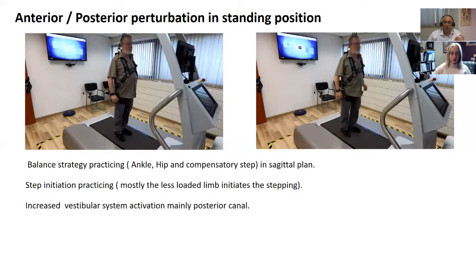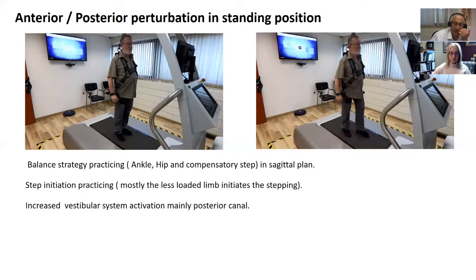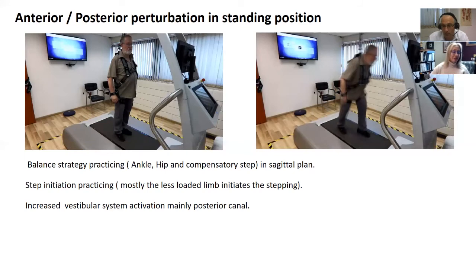That's correct. Now, we can also mix this with instructions. You quite rightly pointed out on that left-hand pane, the way that he is using that hemiparetic leg to actually contract and take the weight as he's moving his left leg back. Now, we can actually do that with instructions by telling him to put weight on different legs. So, for instance, if I told him to load up the left leg, then I could force him to take a step backwards with the right leg. Okay, and that would be working on hip flexion, hip extension to take that leg backwards. Okay, so that could be, you know, one of our goals. So what I'm trying to point out is by mixing up instructions with perturbations, again, we can elicit the response that we want to formulate. Correct. Yep. Okay.